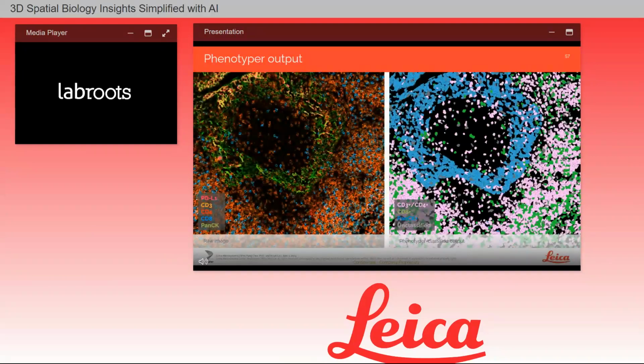Switching back to my slides. Here is an example of a larger image with the phenotyper applied. On the left is the raw image, and on the right is the phenotyper output, with 3 classes that we've identified, plus unclassified in gray.